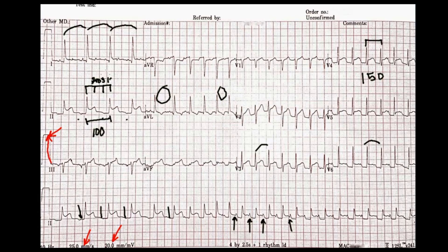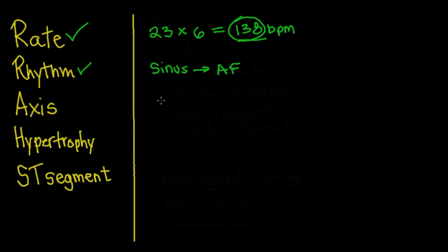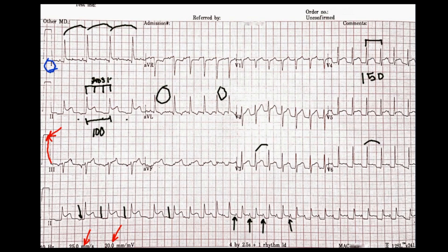Next is axis. One technique is looking at the limb leads and picking the one with the highest positive amplitude — in this case it's lead I. That's going to be the direction of the axis. Because lead I vector goes in this direction, that's generally the direction of the axis. Since AVF is going down, it should be the most isoelectric — and in fact, AVF shows the least amplitude. So the axis is most in line with lead I and perpendicular to lead AVF.